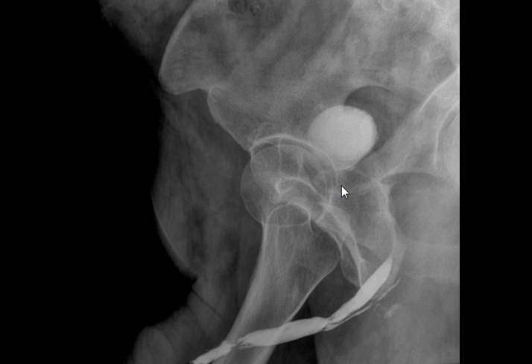So the more you push, the more painful it will be. You just put the tip of the Foley, including the balloon. You look for where the balloon of the Foley is. You put the Foley balloon in the urethra, you see the balloon has entered the urethra, and you inflate until it locks.